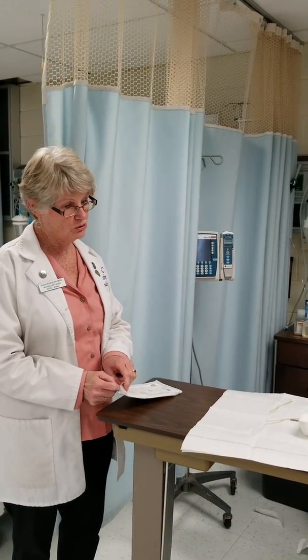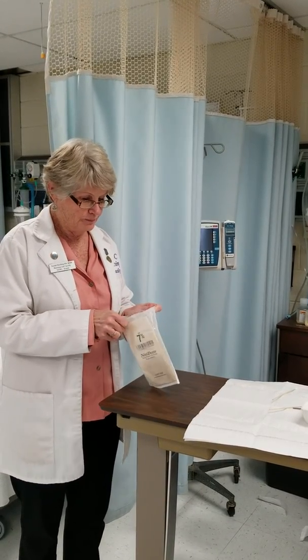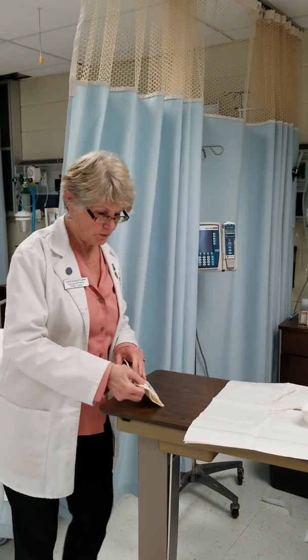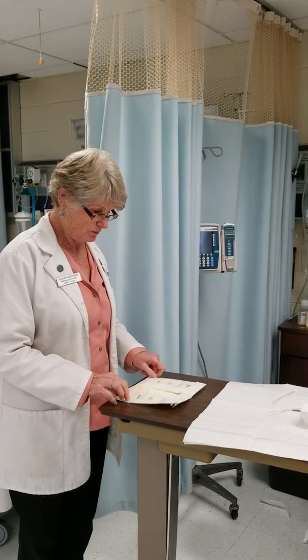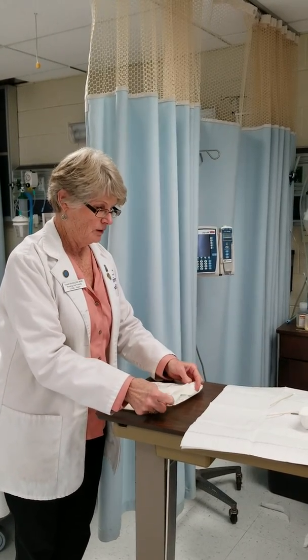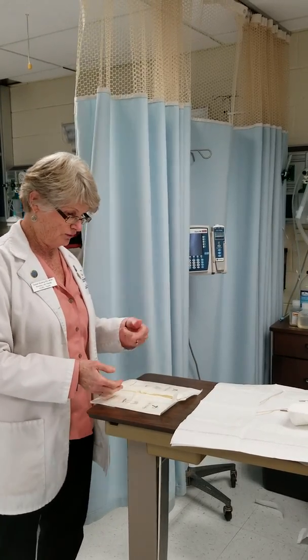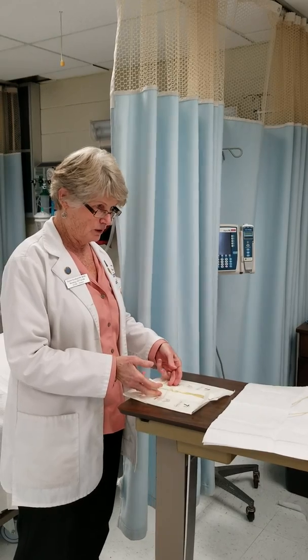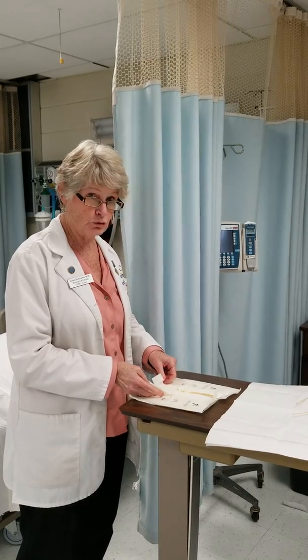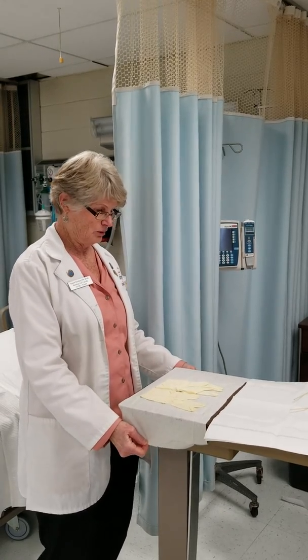Next, to apply my sterile gloves, I'm going to open my packaging, peeling it apart, and removing my gloves. I will open the gloves, the top and the bottom, so that you do not want your glove packaging to flip back onto the field because it would become unsterile. So I'm going to grab, I have the edges here, they're considered the 1-inch border, and I'll open my package and go ahead and get my gloves on.